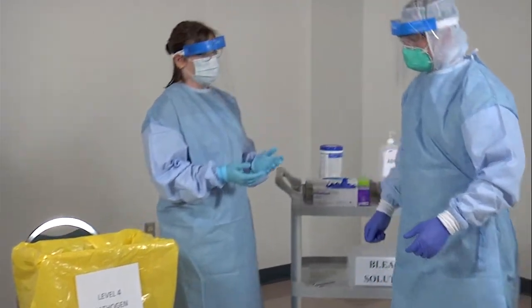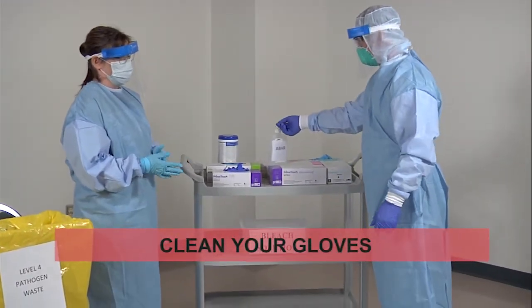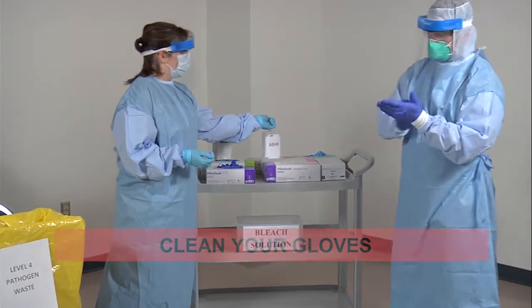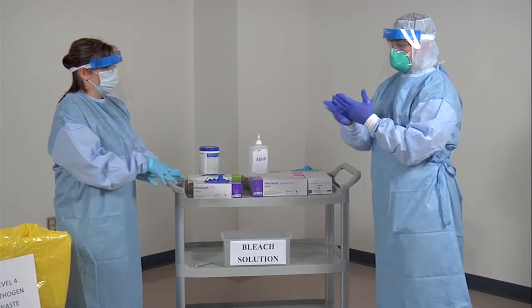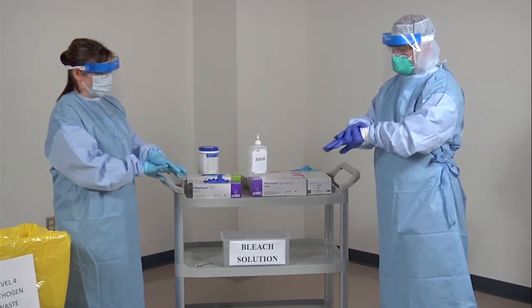Clean your gloves with an alcohol-based hand rub. The quality monitor will also clean their gloves at any point during the doffing process if they feel their gloves may have become contaminated.